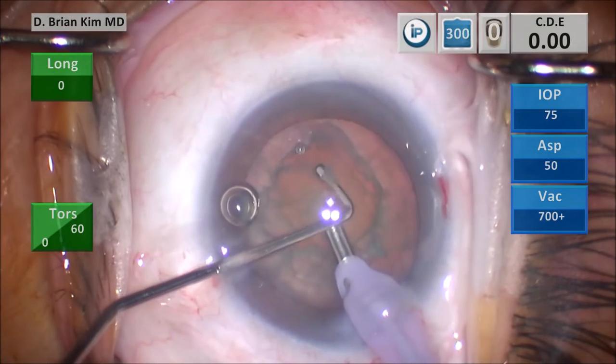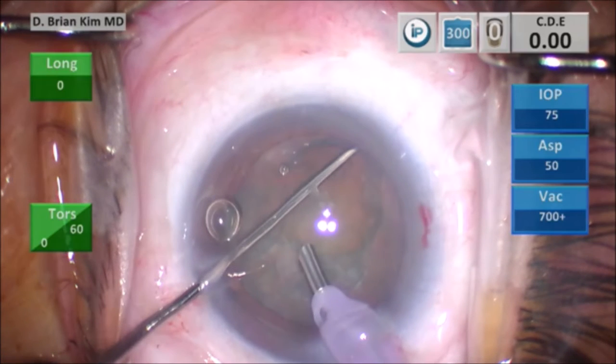Where my chopper is centrally now is the endonuclear surface. I'm going to go under the epinuclear ridge, rotate my chopper in position, pointing the chopper down towards the nerve, and now the chopper is in the ready position.